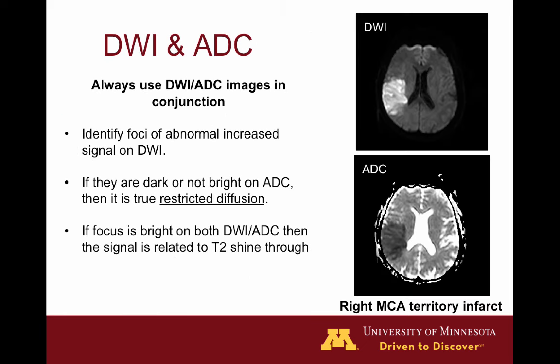Here we have an example of DWI and ADC images viewed in conjunction to come up with the correct diagnosis. On the top image there is high signal within the right cerebral hemisphere in a portion of the right middle cerebral artery territory. Looking at the same region on the ADC map, we see low signal, representing true restricted diffusion — this is a subacute right MCA territory infarct. Over the next few days the ADC signal becomes brighter, and when DWI is still bright but ADC is also bright, that's called T2 shine-through. By correlating DWI with the ADC map and other sequences, we can pinpoint with good accuracy within a few days when an infarct happened.